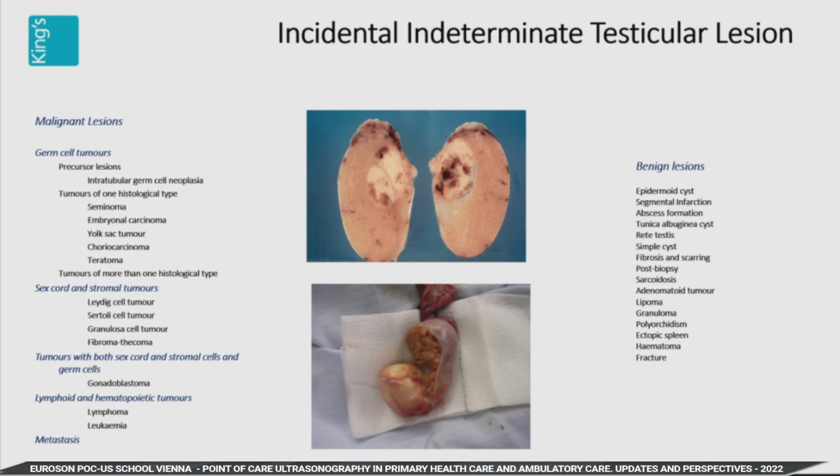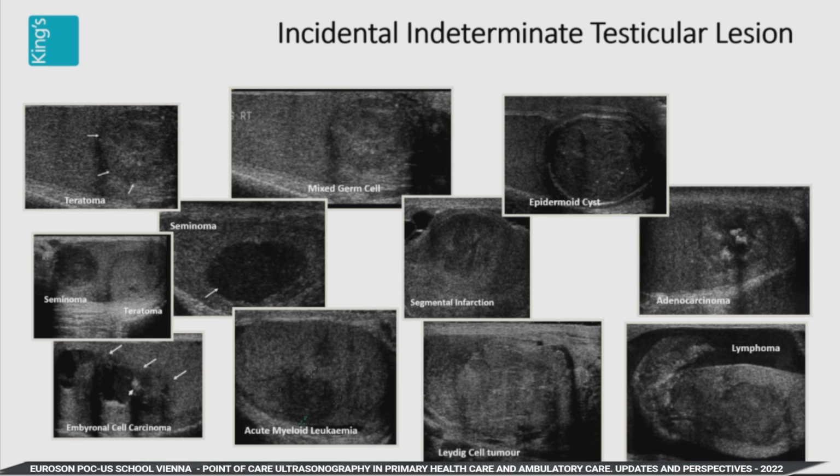The main thing here is to realize that clinical medicine or clinical urology lags behind the imaging techniques that are being developed. So the clinical practice in urology is slowly changing to what you are now finding on imaging techniques. So the old urological practice was orchidectomy if you could feel a lump in the testes. This may not always be true any longer. And this is a whole array of tumors that you'll see. These are the malignant tumors that you'll pick up in the testes, but hidden among these malignant tumors are a couple of benign tumors that don't warrant orchidectomy.